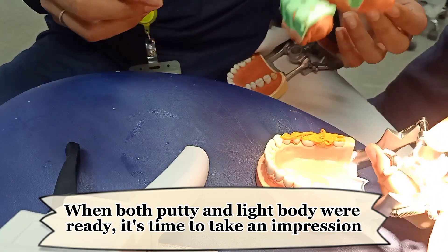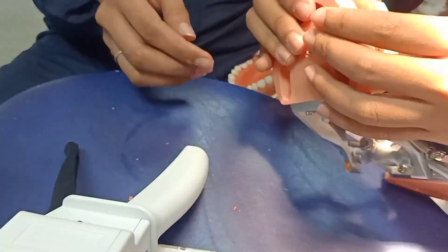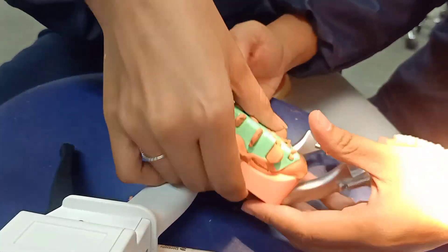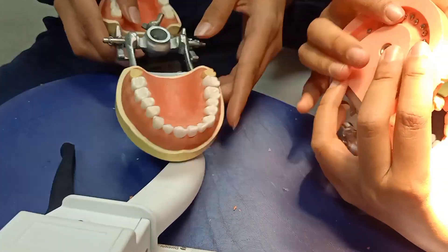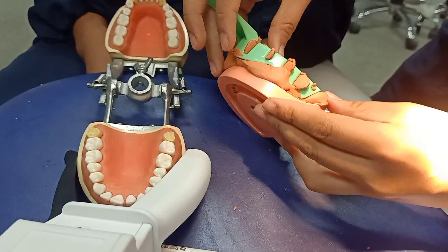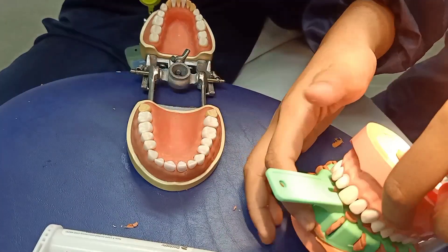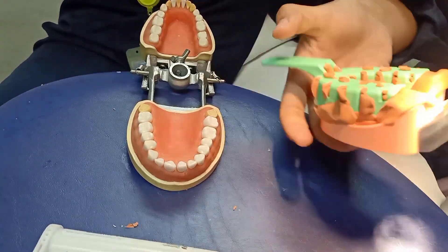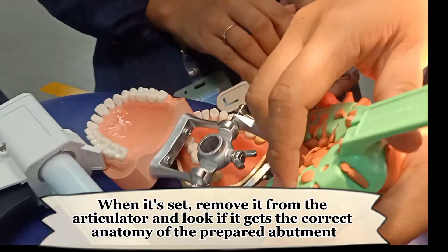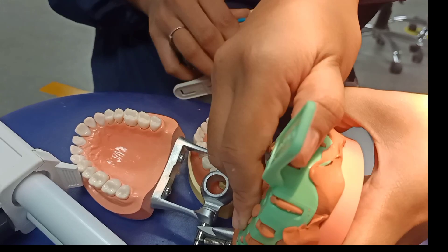When both putty and light body were ready, it's time to take an impression. When it's set, remove it from the articulator and look if it gets the correct anatomy of the prepared abutment.